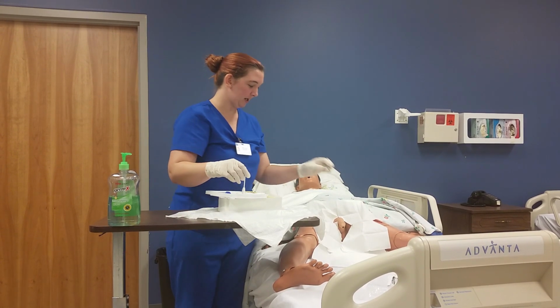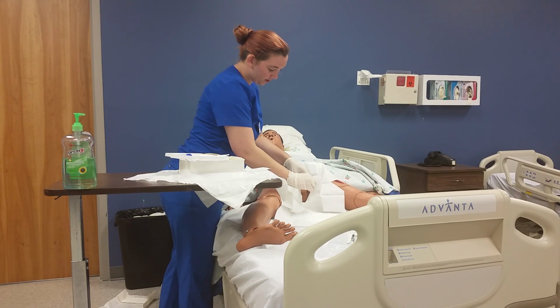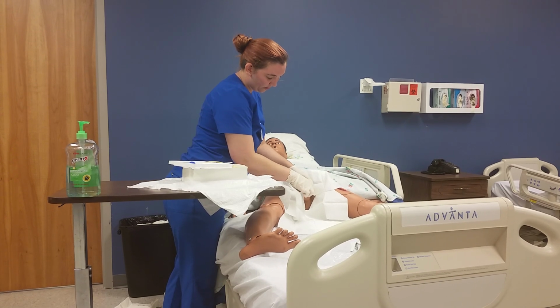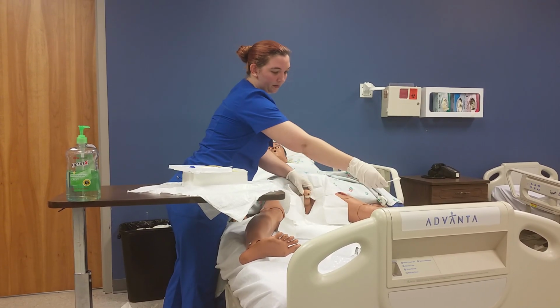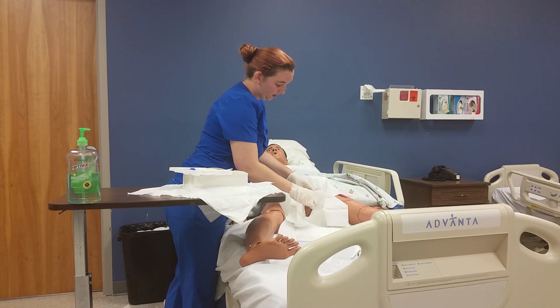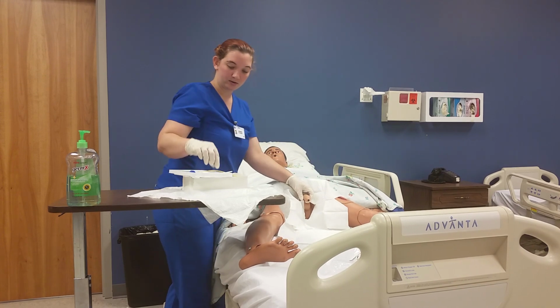With my non-dominant hand, I'm going to grab onto him. I'm going to take the first one, start at the top, and go into a circular motion. And without going across my sterile field, I'm going to go around and throw away. The second one, we're going to do the same thing. Go around here, then we're going to go across.